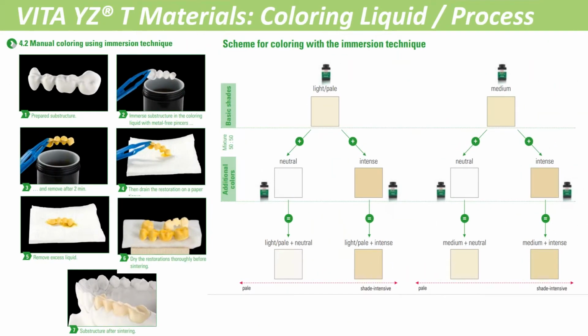So how do we affect color when it comes to zirconia? Again, it depends on the type of restoration we're doing. You can get zirconia just white, and you can stain it to match. The example shown in the picture here would be dip staining.